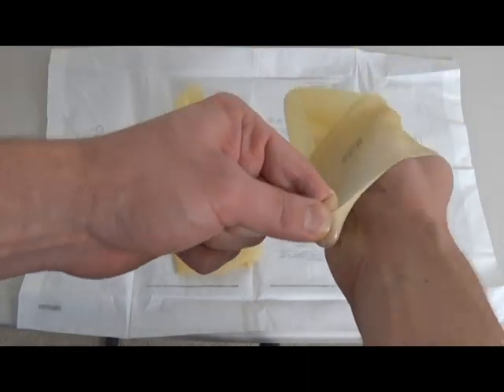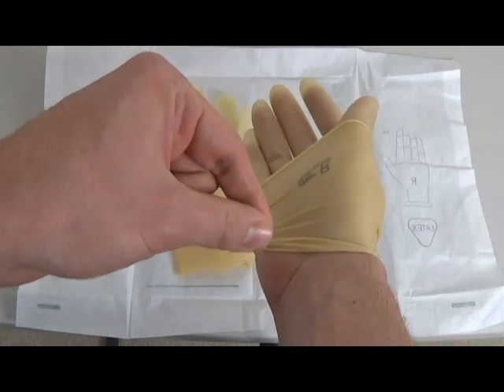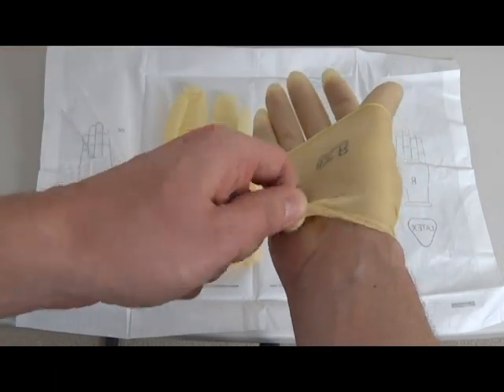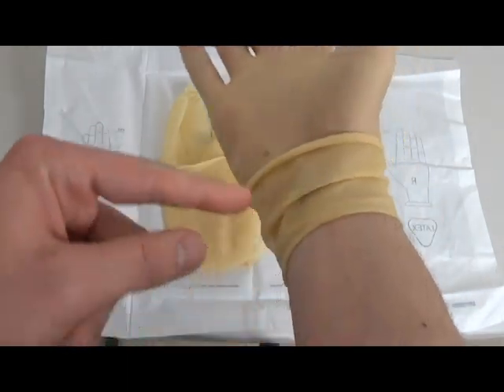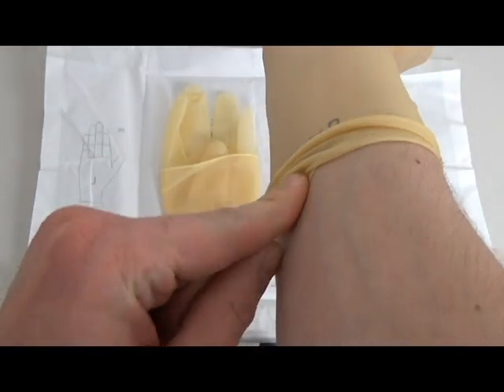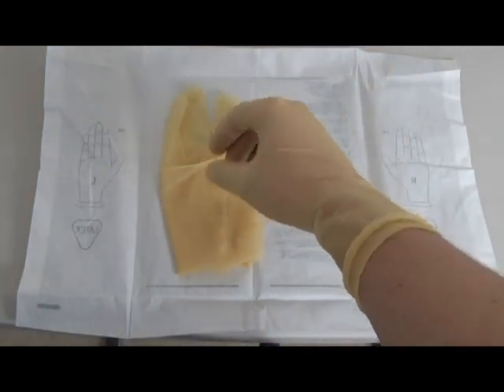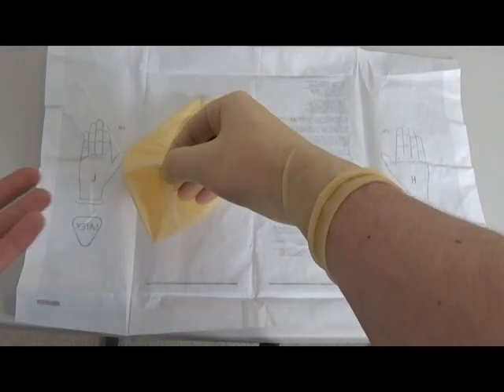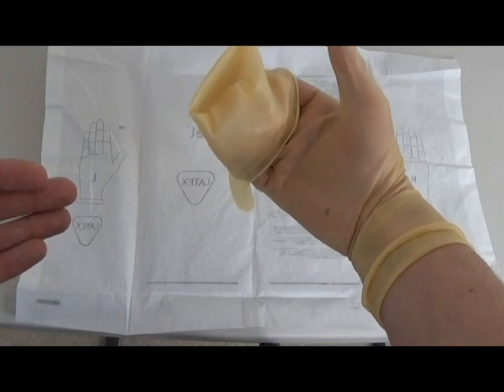It's going to slide. Another temptation that I feel people have is that once they have the glove on, they try to pull on this, right? And if you grab here, again, it's questionable if you're going to keep it sterile. So just keep going with this edge right here and just let it go. And if you have a problem with it hanging like that, then just grab it a little more and try to stay on the inside, just in case it folds back on itself. Again, same thing on the other side. With this one, you do not want to grab it here because your hand is going to touch your glove and you're contaminated. You want to grab it from here. So that's why the right glove is a little bit different than the left.